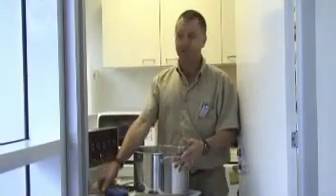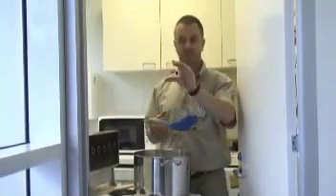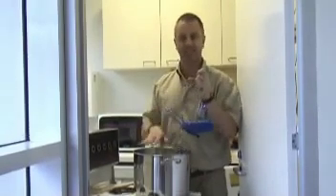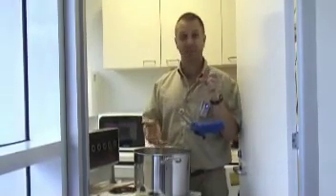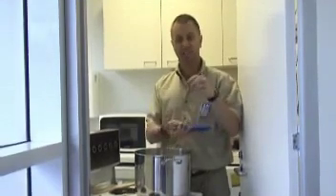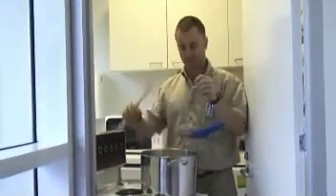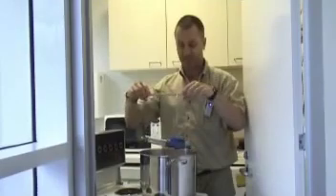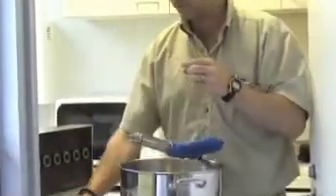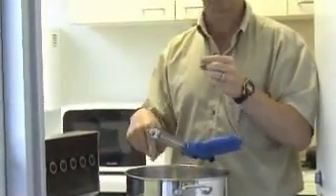The first thing to remember with the applicator is that you will need some string or some wire to suspend the applicator, and it is very important that the applicator does not touch the bottom of the pan, because the bottom of the pan will burn the instrument. The instrument will get too much heat and that can melt the product. So I've just got a wooden spoon which would go through like that, and the gun would go into the container. I also have the needles. The needles can go in the water and they can boil as well.